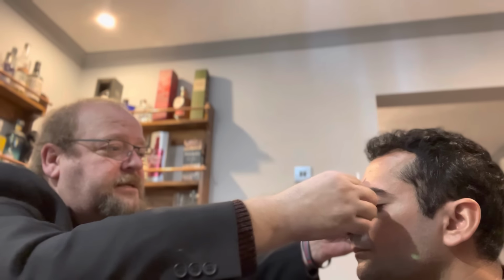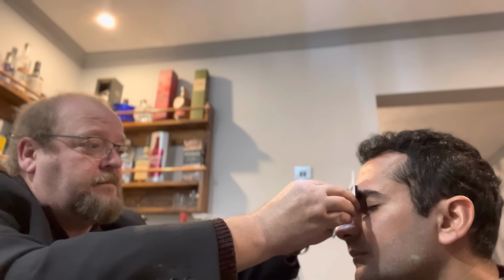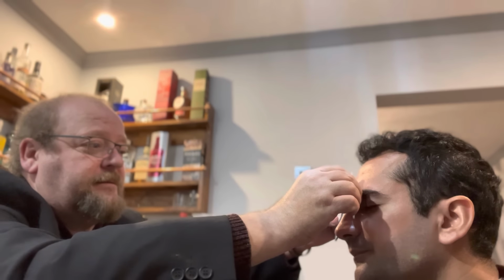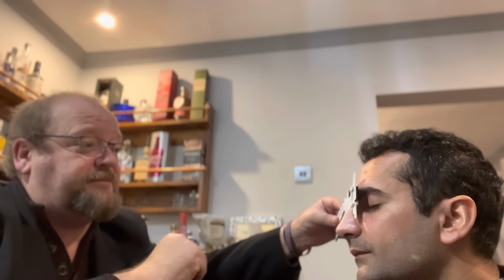So as I do that, I think it'll do a better measurement this way. That's better. Does that feel tight? Slightly. What I want is the point of contact but not tight. That's better, isn't it? Yes, better. So at 10, I've got that at 25.